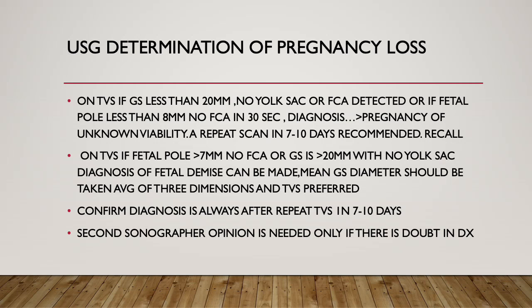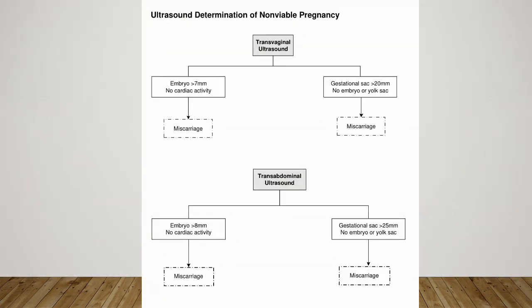A second sonographer's opinion is only needed if there is a doubt in the diagnosis, or a doubt in the competency of the sonographer who is doing the scan. If the sonographer is competent and has a good number of clinical practice cases, there is no need for a second sonographer. Now this table is very important for the written exam and also for the OSCE, because a station will come for counseling of a patient with these features.